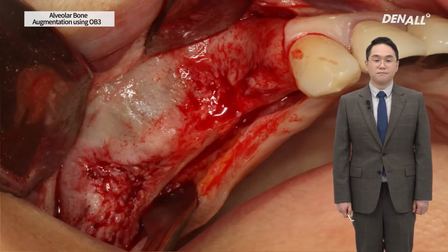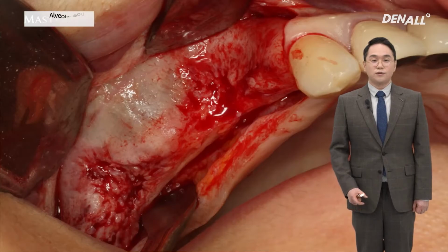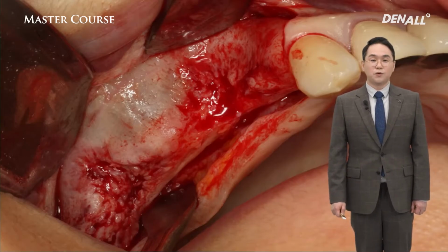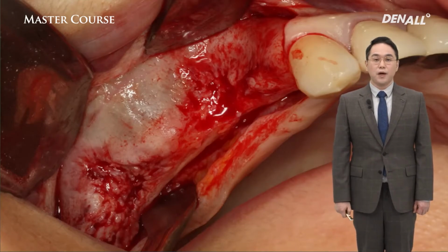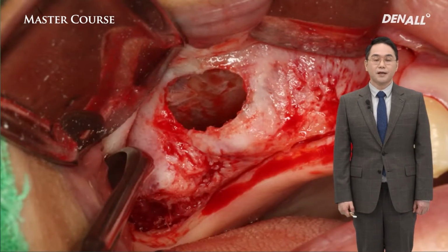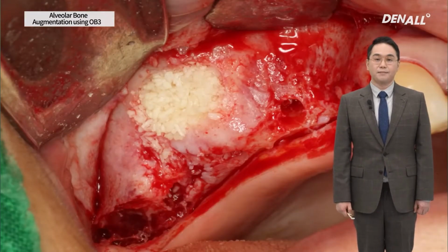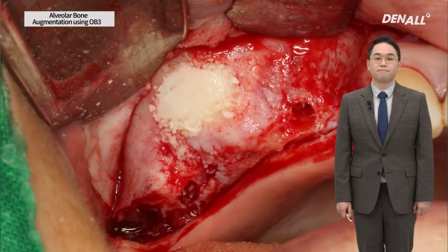Flap is raised. As we saw in the pre-op CT, the residual bone in the posterior region to the sinus floor is only 2 to 3 millimeters. So the lateral window approach is used to lift the sinus membrane and to perform sinus bone graft. The window is removed. The sinus membrane is lifted, and inside allograft bone graft material is packed. After that, the removed window is repositioned.